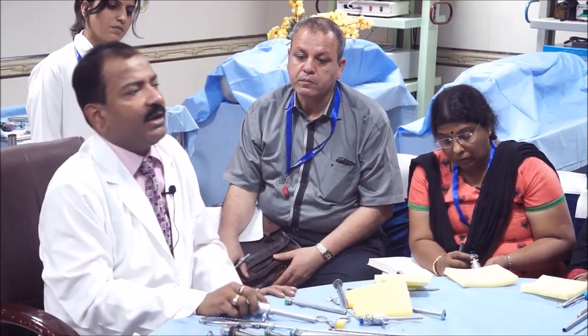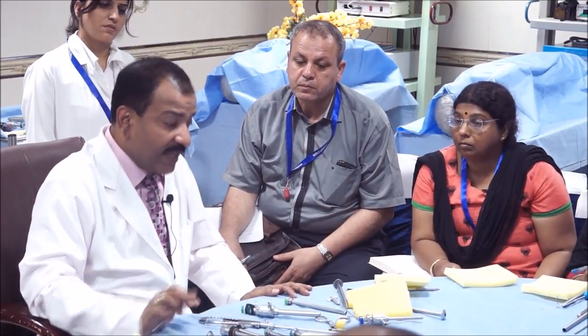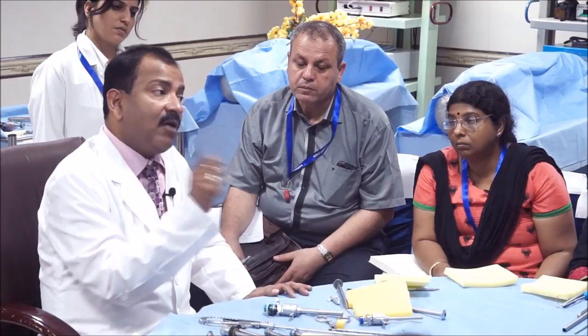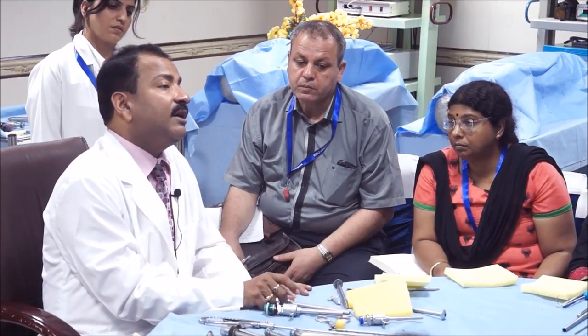So, both have their own importance, advantage and disadvantage. But the long reducer can, if you have it, you don't need the short. You can do without, but without a long reducer you have difficulty in suturing, knotting or tissue retrieval.